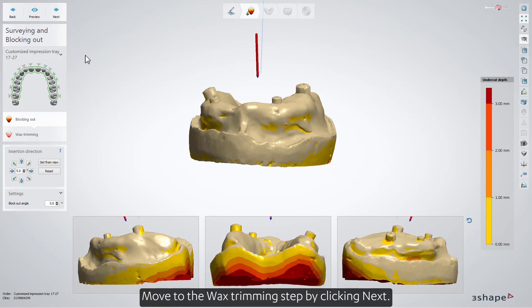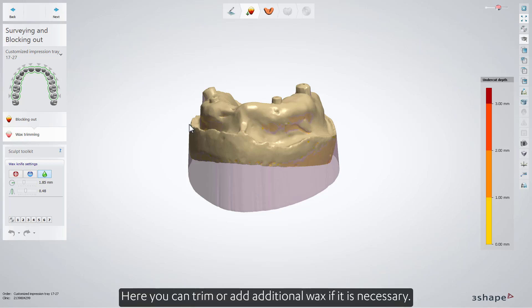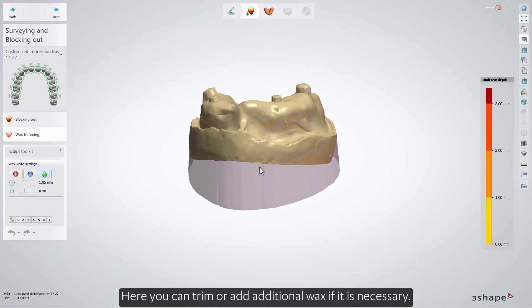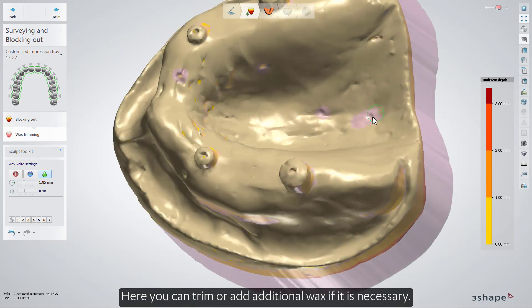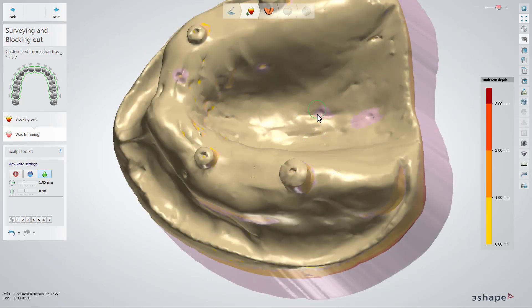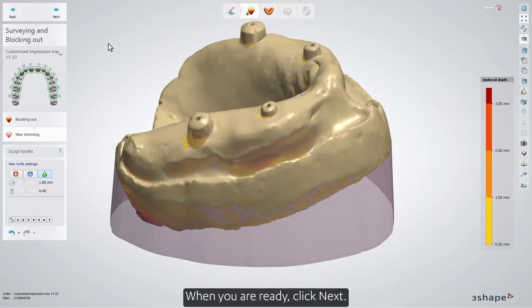Move to the wax trimming step by clicking Next. Here you can trim or add additional wax if it is necessary. When you are ready, click Next.